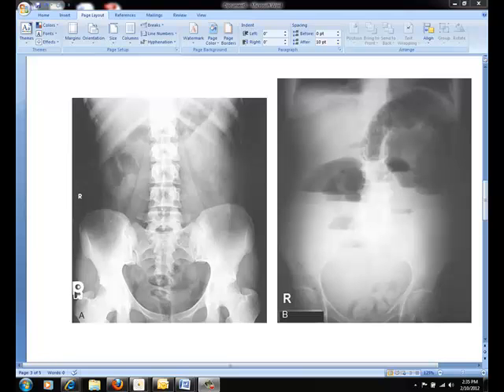Looking at the radiograph on your right, be sure to make the diaphragm visualized without motion. This particular image on the right is of poor quality, and I believe this is due to a large patient size.